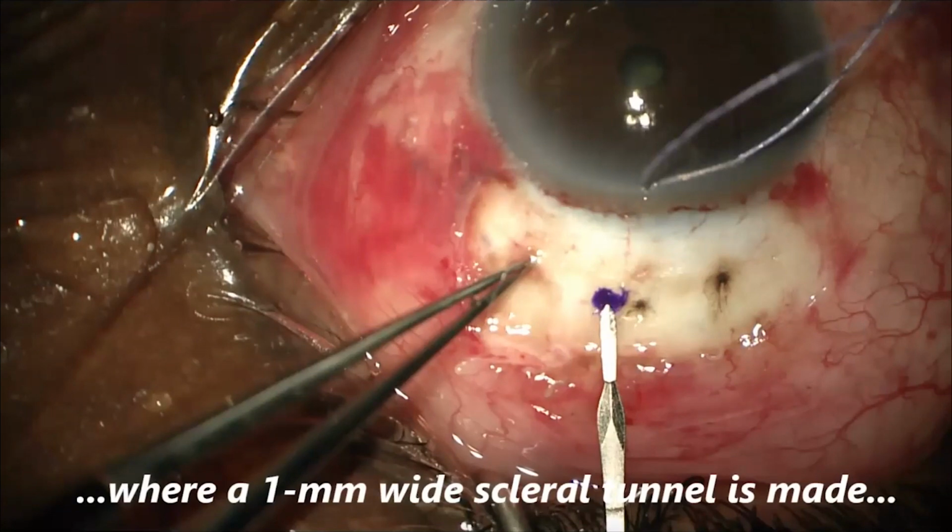Here is a double step knife that you will use to make your entry. The reason is that you want about a 1 millimeter tunnel going into the anterior chamber. But you'll see here, there is a wider portion of the blade, and this is used to create a pocket right here in the sclera where the fins of the device are going to get inserted. You don't really want this portion of the blade making it into the anterior chamber.